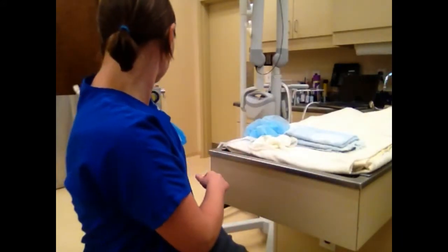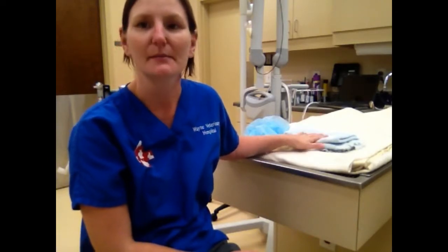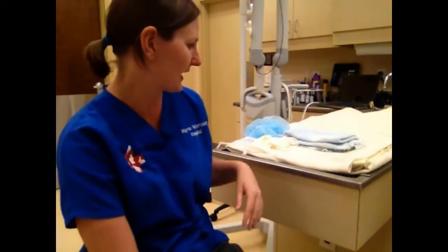Sorry, that's my anaesthetic machine. We have a heating pad set up here with a blanket on the top of it to keep the dog nice and warm, prevent any hypothermia. And I have some towels to help position the dog. It's important that when we're performing the dental that we minimise the amount of water and debris going down the throat to prevent aspiration. So we're going to use a cuffed ET tube to help prevent this, as well as some gauze pads pushed down into the back of the throat to prevent any excess water from getting down there.